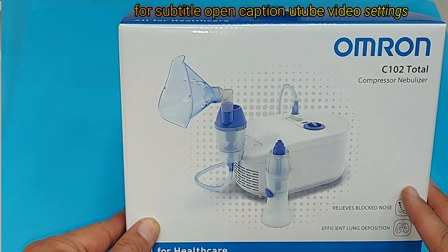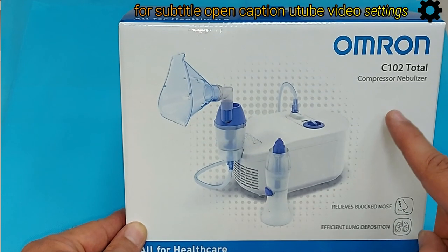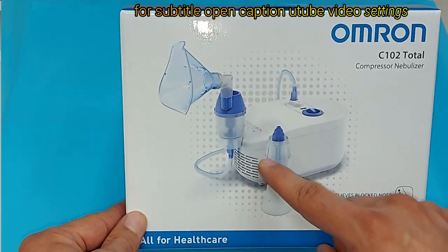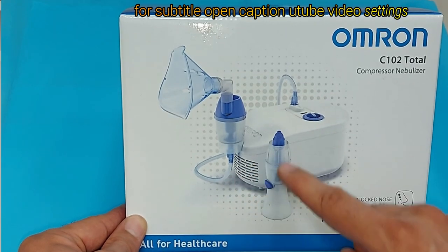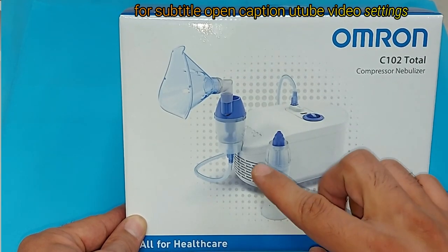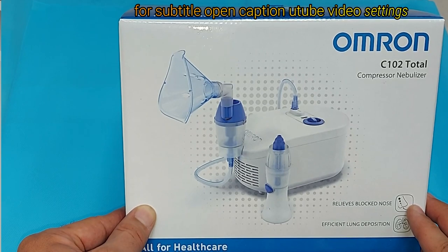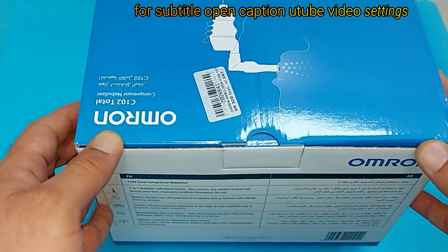Hello viewers, welcome to Pharmacist Online. In this video tutorial I will unbox the Omron C102 Total Nebulizer, and after unboxing I will show you how to connect the different parts, how to use this nebulizer properly, and how to use the medication in this device for nebulization. Stay with me until the end and I'm sure you will get much more information about using this device properly.